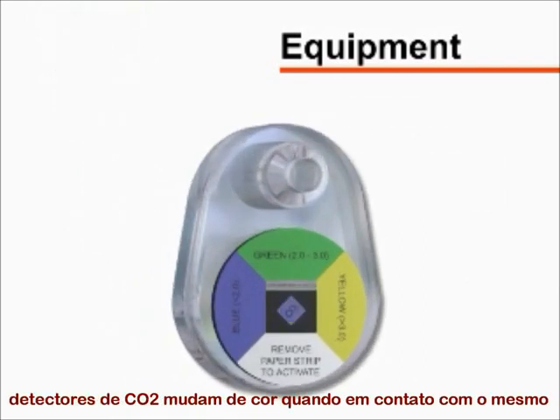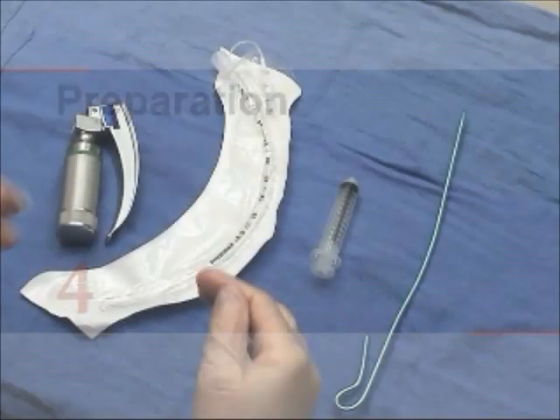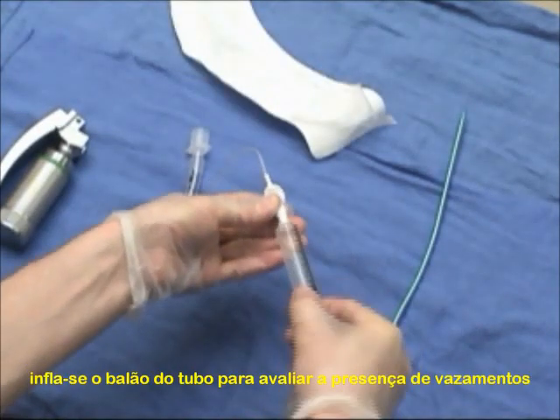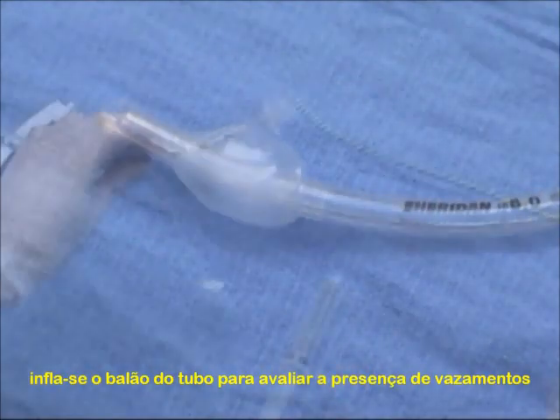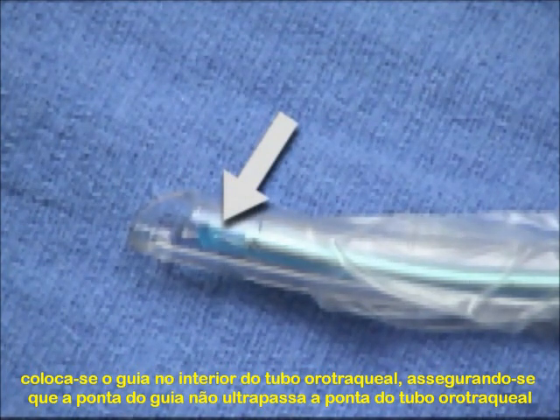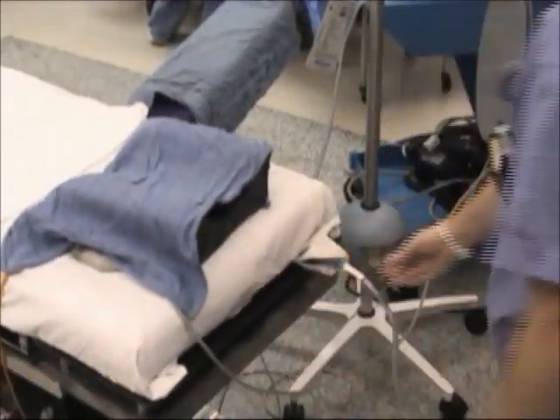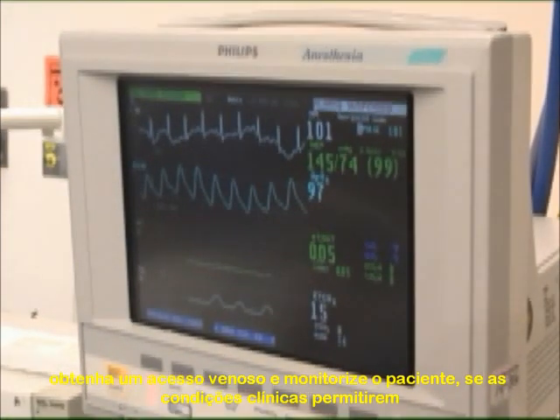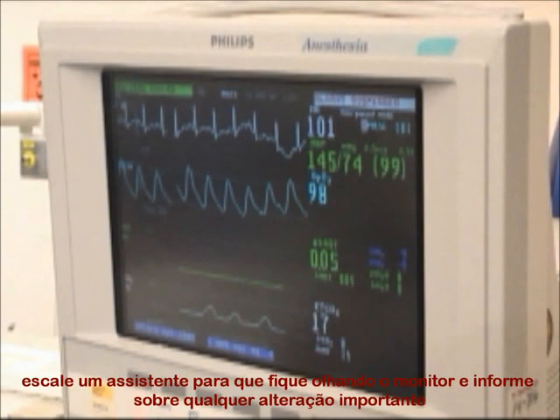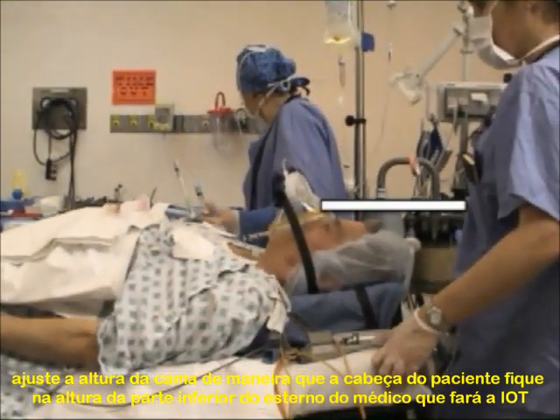Commonly used detectors change color in the presence of carbon dioxide. Before proceeding, be sure that all equipment is readily accessible and functioning. Inflate the cuff of the endotracheal tube to check for leaks. Insert the stylet into the endotracheal tube, making sure that the tip of the stylet does not extend beyond the end of the endotracheal tube. Be sure that the suction catheter is secured within easy reach. Obtain intravenous access and place the patient on a monitor if time and conditions permit. Assign an assistant to watch the monitor during the procedure and report any changes.